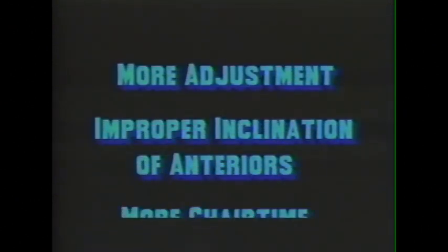The records required to accomplish this are a Facebow transfer and a centric relation record. To simulate the gliding or transitory movements requires an additional record to set the inclination of the condylar paths. If this information is not available to the technician, the net result is often an increase in occlusal adjustment, which may destroy the original occlusal anatomy. There may also be a problem with attaining the proper inclination of the anterior teeth or crowns. This all adds up to an increase in chair time for the dentist.